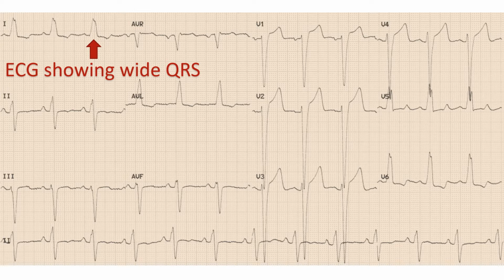Usually, ECG will show a wide QRS complex with a left bundle branch block pattern in those with left ventricular dyssynchrony. In left bundle branch block, there is delayed activation of the left ventricular lateral wall compared to the interventricular septum, leading to dyssynchrony of contraction.